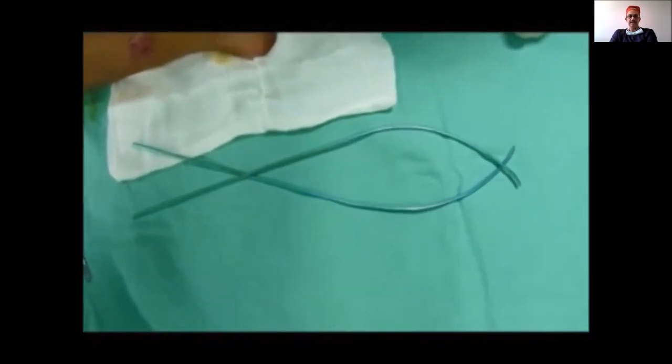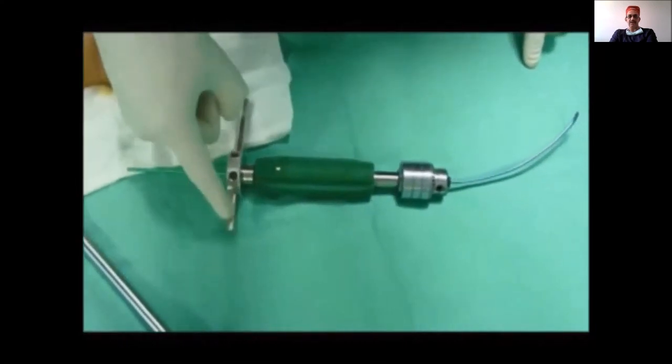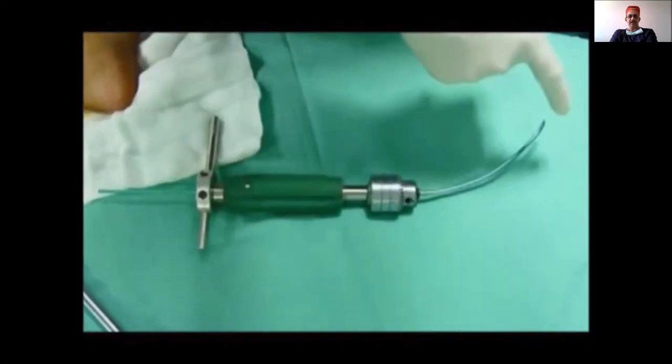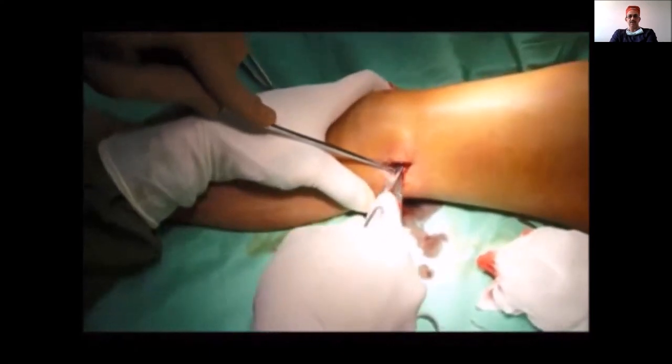The nail should then be loaded onto the T-handle with the chuck such that you know the alignment of the curve along one of the prongs of the chuck, so that you don't have to take a C-arm shoot to confirm orientation.